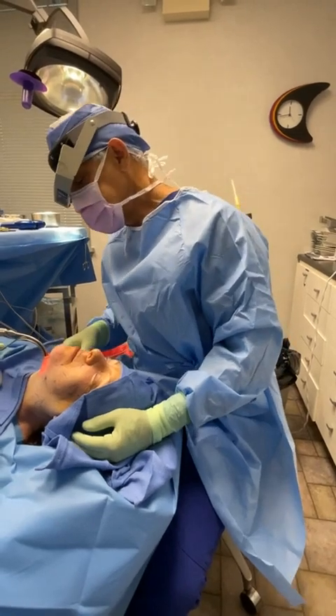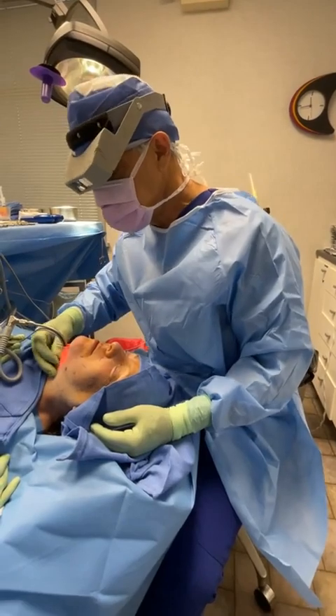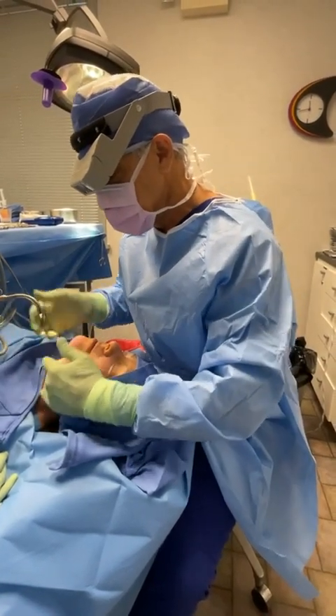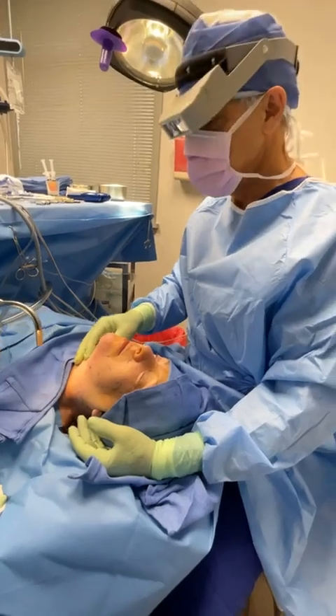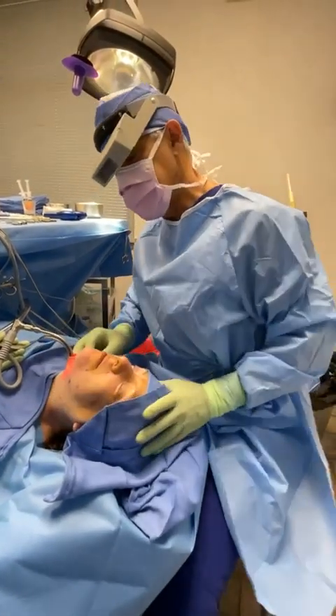At the moment we're also working on the neck. The neck has much less fullness than it had a minute ago — it's getting to be a very nice sculpted, youthful-looking neck. It was full here a few minutes ago and now it is not, because we did some liposuction.